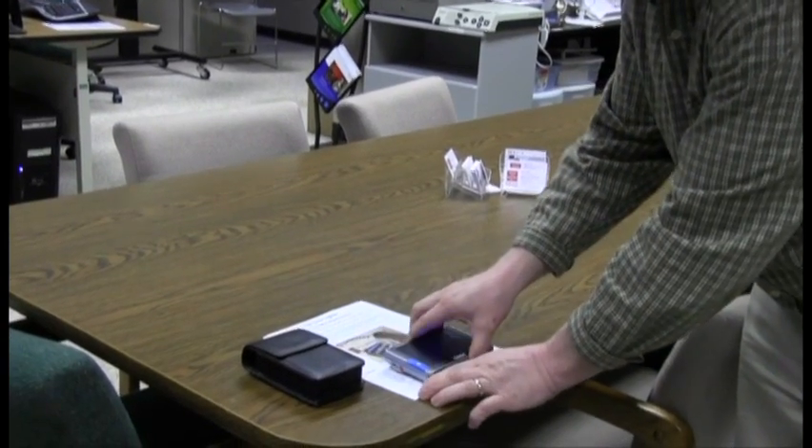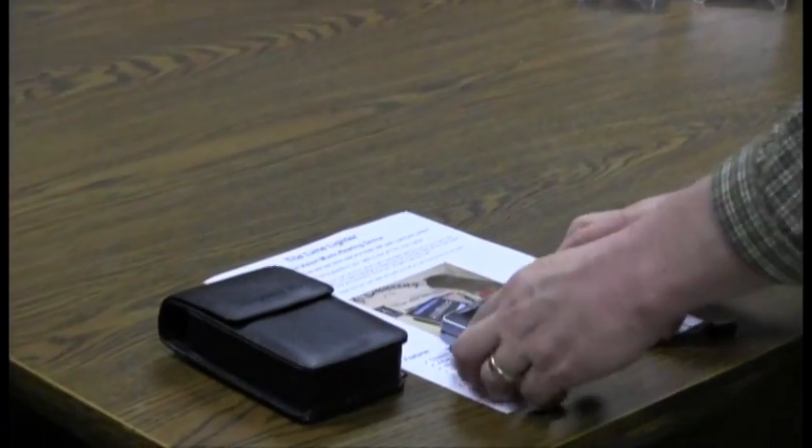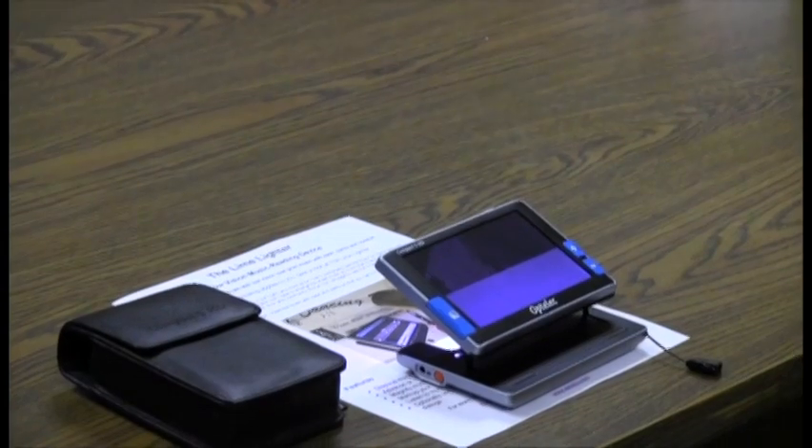One thing I also like about it is when the device is off, you don't have to turn it on with a switch. You can simply flip it up and out, and the device automatically turns on for you, knowing that you're ready to read.